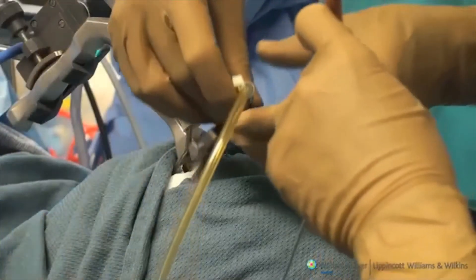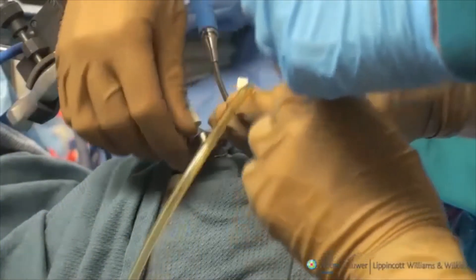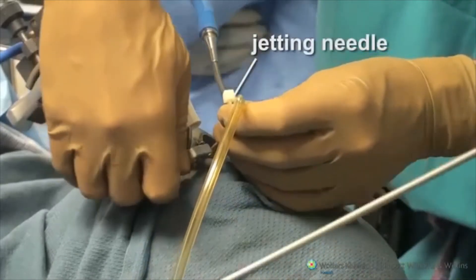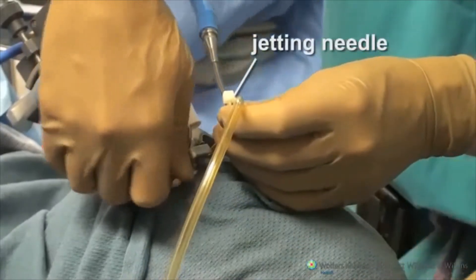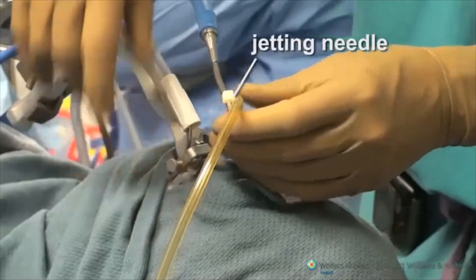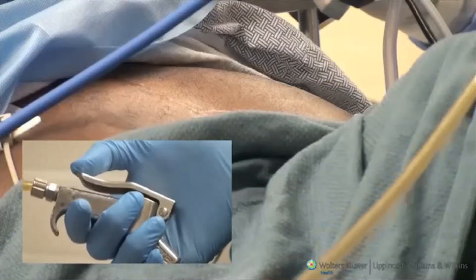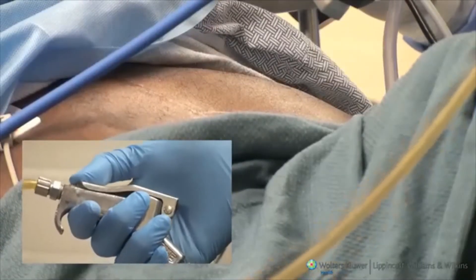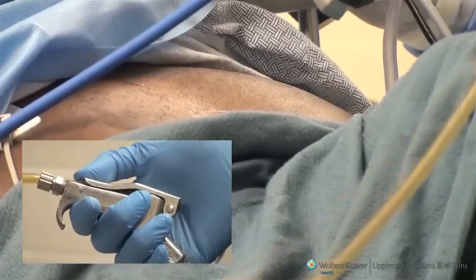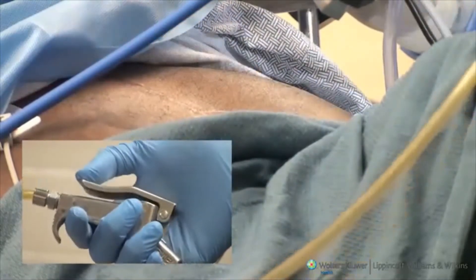In this case, supraglottic ventilation is being used with the jetting needle connected to a suspension laryngoscope for tracheal stenosis laser surgery. Here, we see the thumb control valve being activated. Notice the anterior chest wall rising and the distension of the airway with the delivery of each jet.